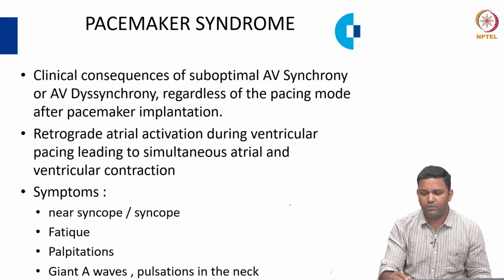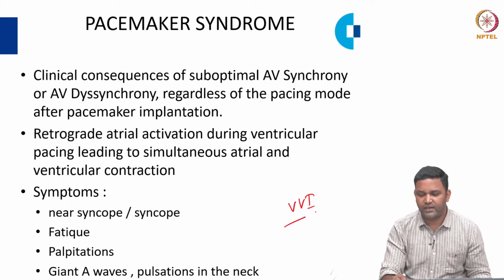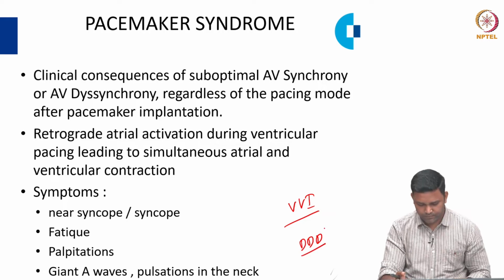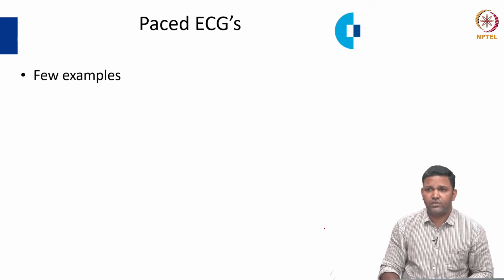So, this is more common with VVI pacemakers, and it's less common in patients with DDD pacemakers. So, I will show you a few examples of paced ECGs.